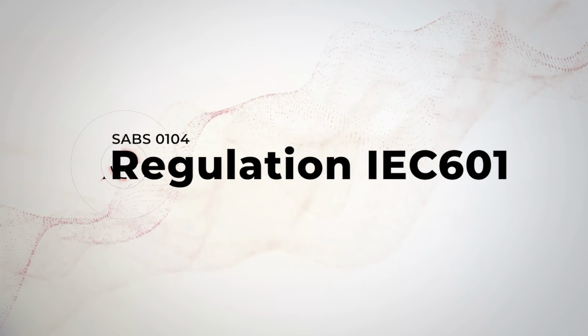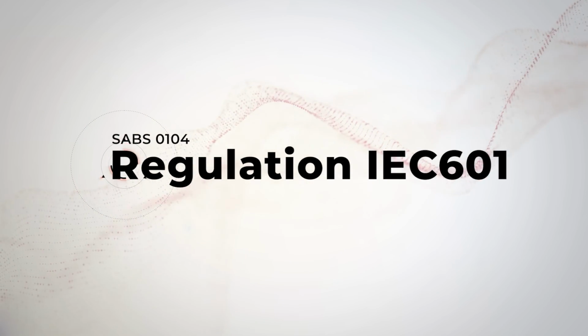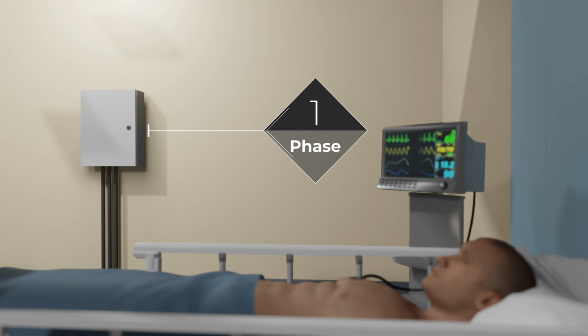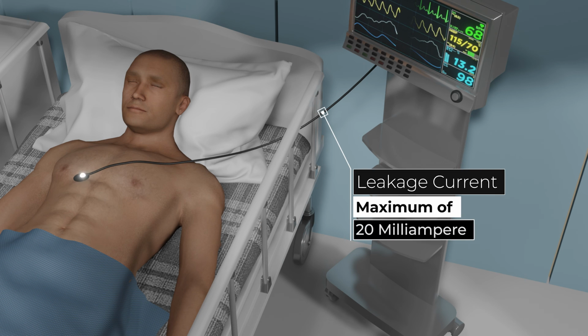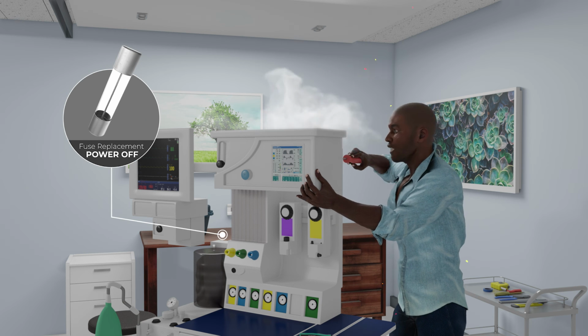As per regulation IEC 601 and SABS 0104, the following measures must be taken. Every patient in a ward must be supplied by one phase only, no mixing of phases. No cross-connection between beds. The leakage current must be at a maximum of 20 mA. Never change a fuse when the power is on.